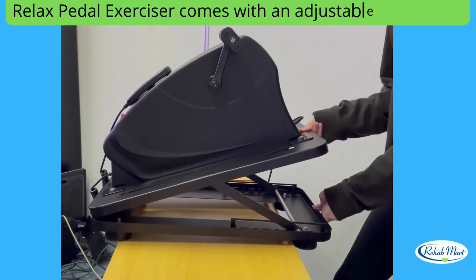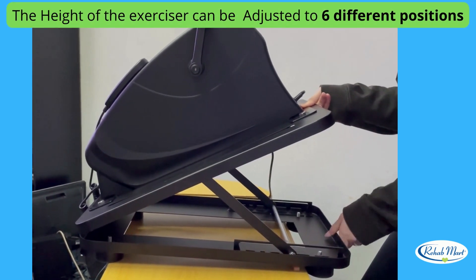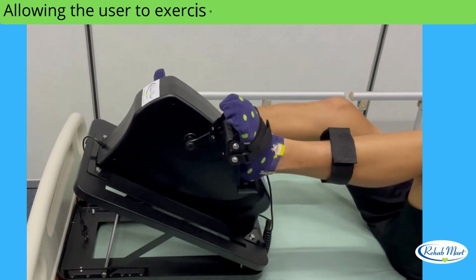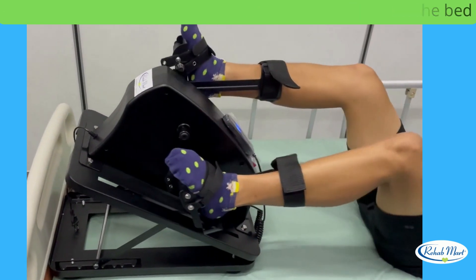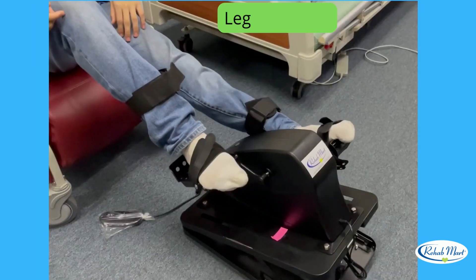Relax Pedal Exerciser comes with an adjustable metal base. The height of the exerciser can be adjusted to 6 different positions, allowing the user to exercise even while lying down on the bed. The users can sit and do hand exercises and leg exercises.